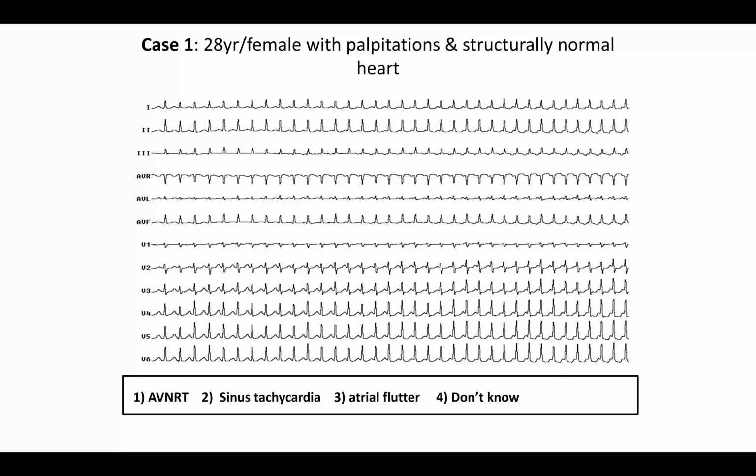That is third. Then SNRT, many people question about it, but we can do it to see for sick sinus syndrome. In SNRT, it's better not to give any drugs when you take the patient in the lab. Pace from high right atrium, that is near the sinus node, not from the coronary sinus. Usually we pace at 3 different cycle lengths, which are at least 100 to 150 millisecond different.